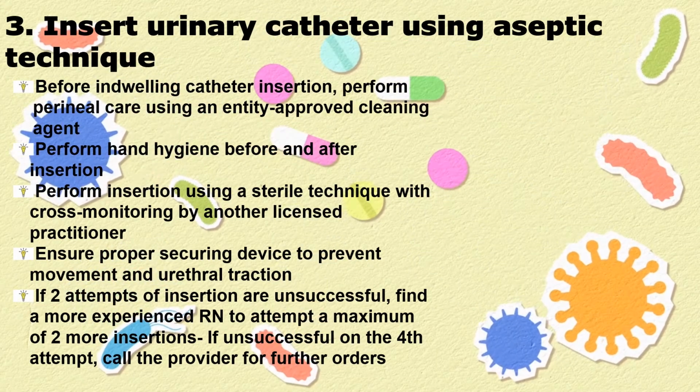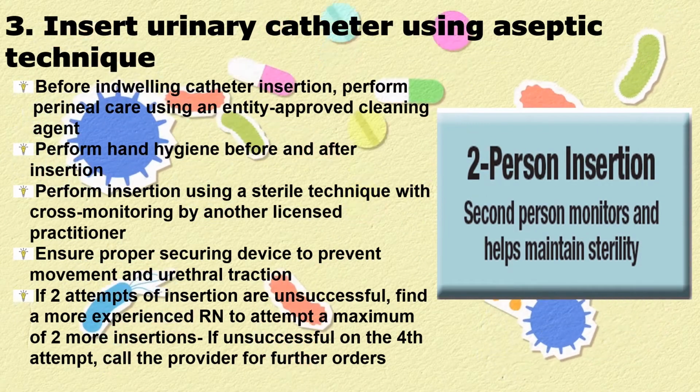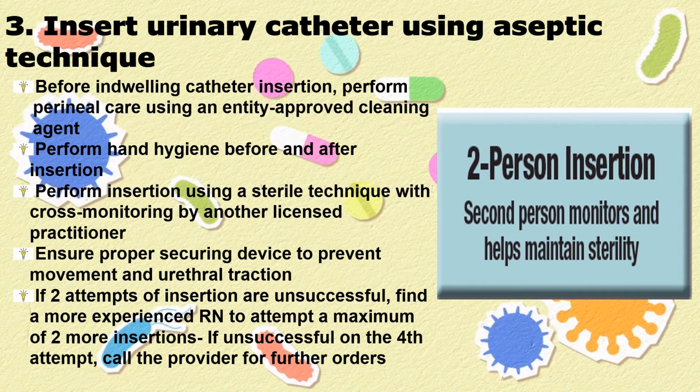And we have to remember that for the third element, we use 2-person insertion as the second person monitors and helps maintain sterility of the entire procedure.